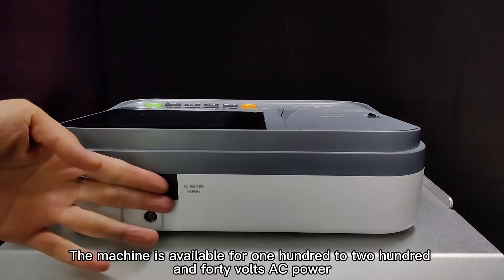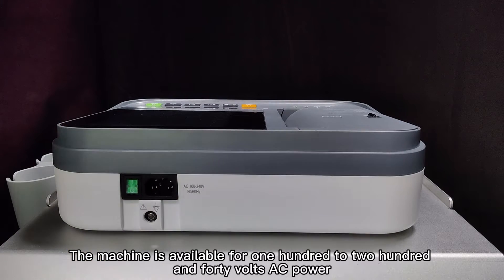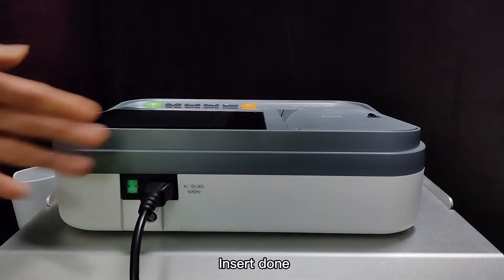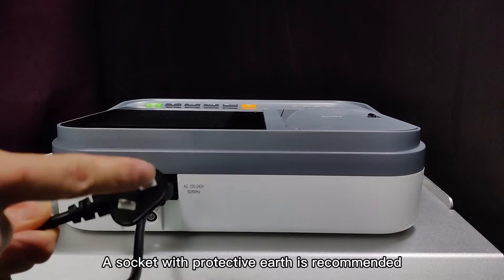The machine is available for 100 to 240 volts AC power. Plug in the AC power, inserting down. A socket with protective grounding is recommended.